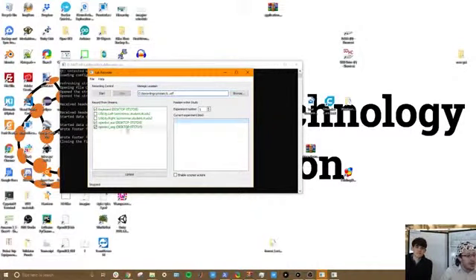And basically, when I start recording, my recommendation is that you wait for the subject to be in a relaxed state. You want to make sure your hands are relaxed in your lap, and you want to wait about 5 seconds before you start pressing buttons, and then 5 seconds after you've finished doing that for about a minute, so that way you can get enough samples.